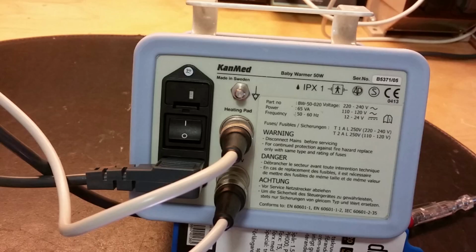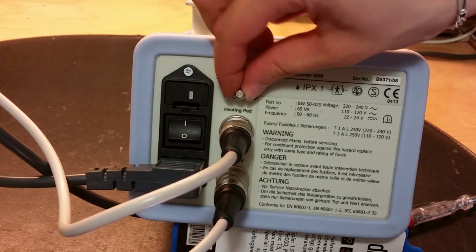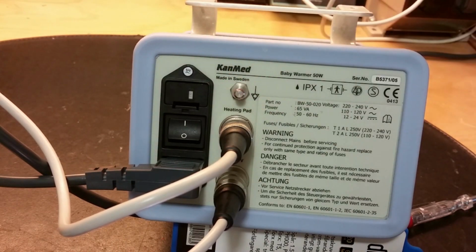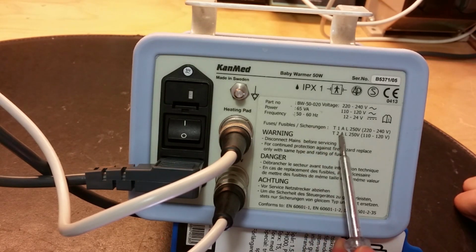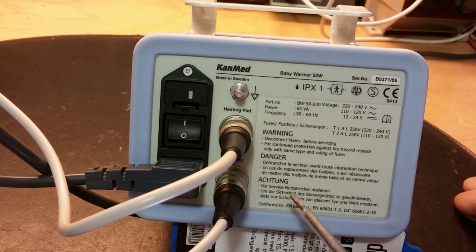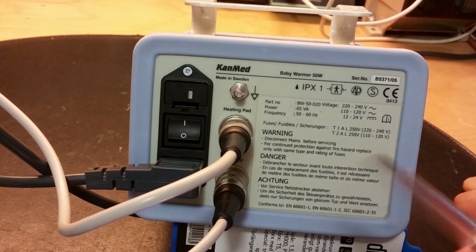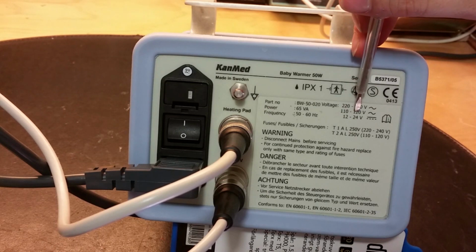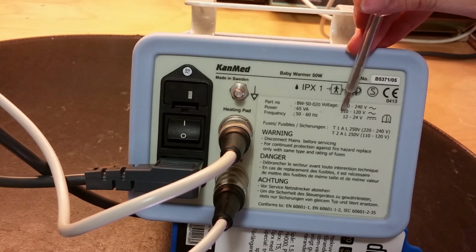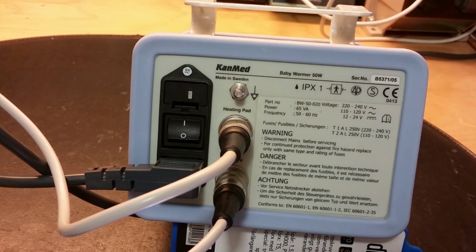It will be interesting. So yes, if I have a look on the back here, we got this earth tap that connects to the actual earth receptacle, with a special earth receptacle in the hospital that we are using. And we got some fuses. Often there are two fuses, one for a live and one for a neutral. And we got some warnings here. Disconnect mains before servicing and stuff like that. That's obvious. And it runs on 220 to 240 volts AC, 110 to 120 volts AC. But we can even use 12 or 24 volts DC.